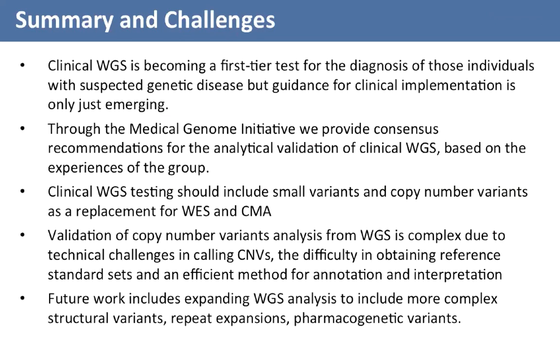I just wanted to summarize by saying that clinical genome sequencing is becoming really a first tier test in diagnostics, but the guidance for clinical implementation is really just emerging. That's one of the reasons for the genesis of the Medical Genome Initiative, and we're providing some consensus recommendations for how to go about analytically validating genomes, based on the experience of the group. We feel clinical genome sequencing should include small variants and copy number at a minimum, and it should be at a place where it can replace whole exome sequencing and chromosomal microarray analysis.